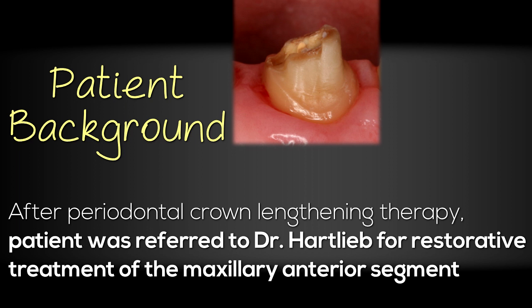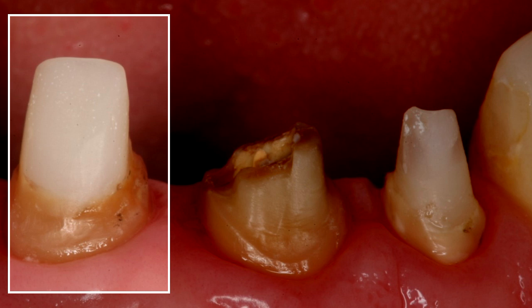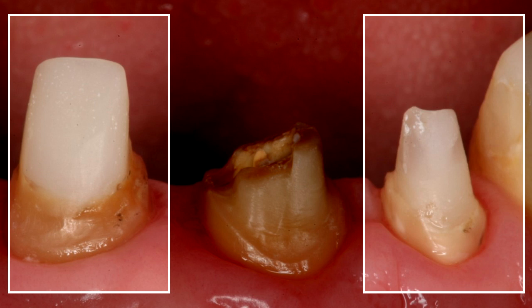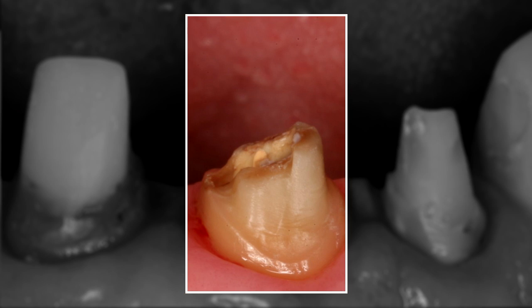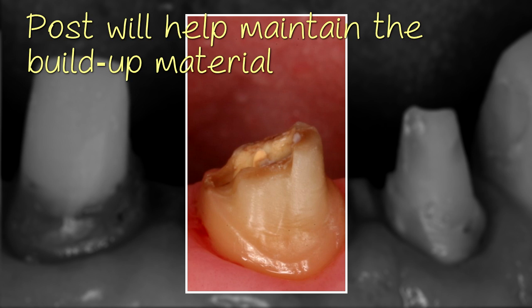This is a patient who has gone through periodontal crown lengthening therapy and was referred to me for the restorative treatment necessary for the maxillary anterior segment. As you can see, there is already a post and core placed on tooth number seven and a post and core placed on number nine. Today we're going to be placing the post and core for tooth number eight. The patient has returned after endodontic treatment on tooth number eight, and you can see the amount of tooth structure available is nice — we have enough ferrule. We want our post to help maintain the buildup material.